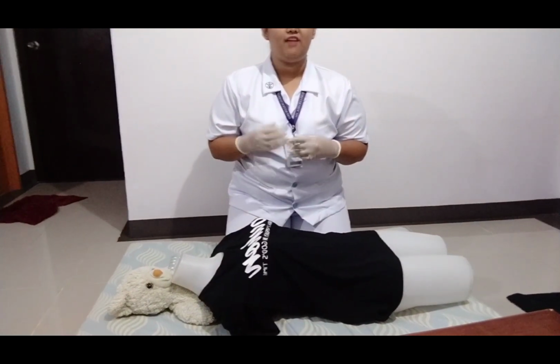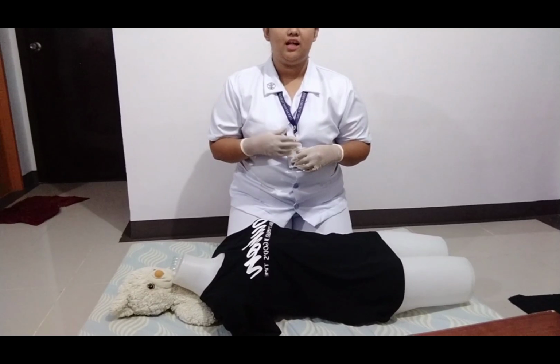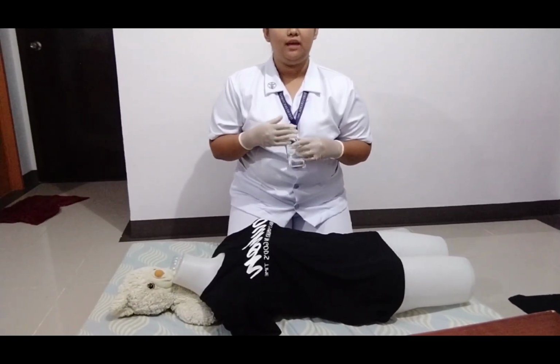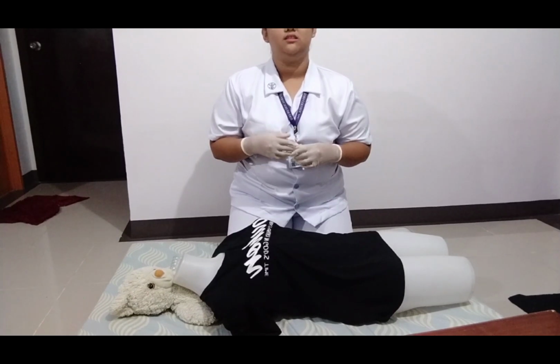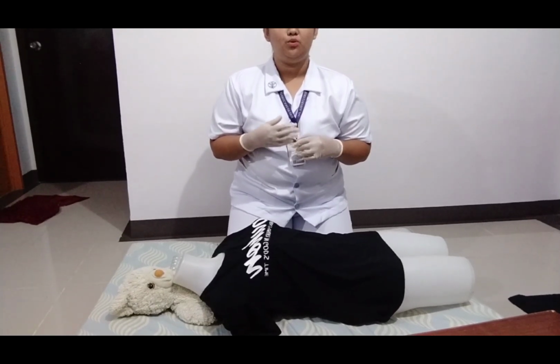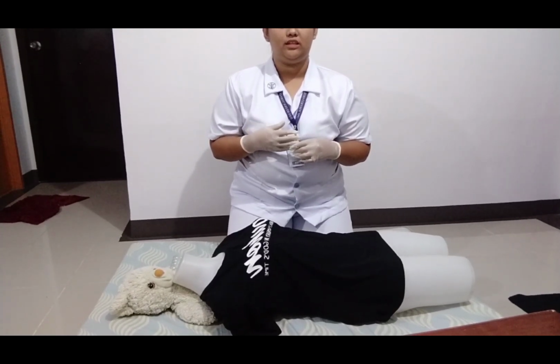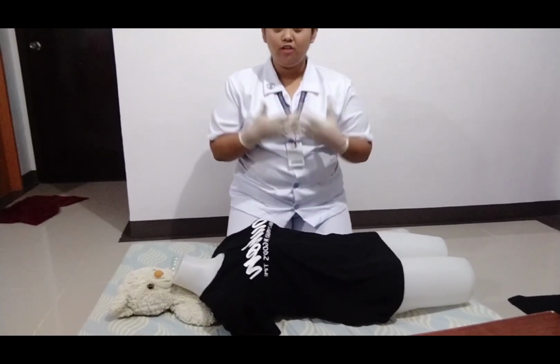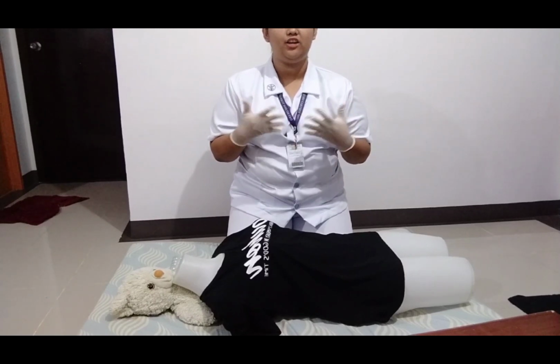A hazard could be a fire, falling debris, chemicals, or anything that could potentially harm us, because if there is a hazard present and we get injured, we will be unable to help and assist the patient. Safety would also include the use of personal protective equipment such as the gloves, which I already have in here.